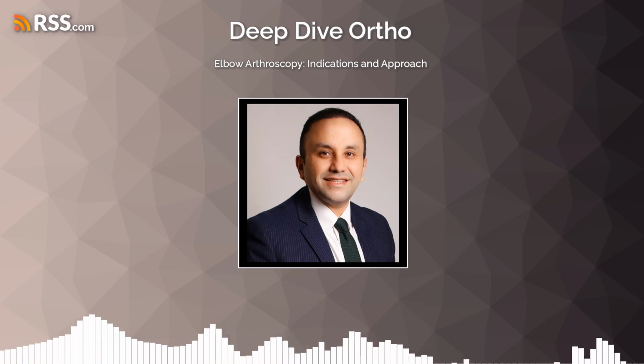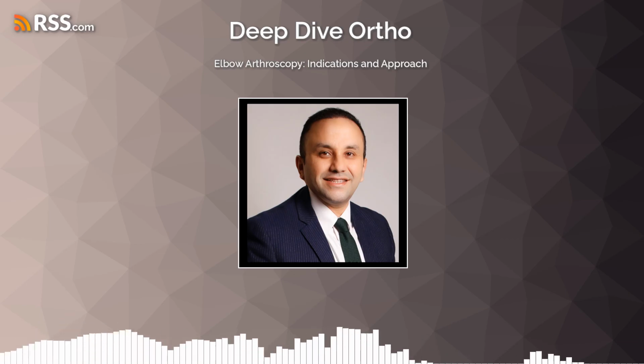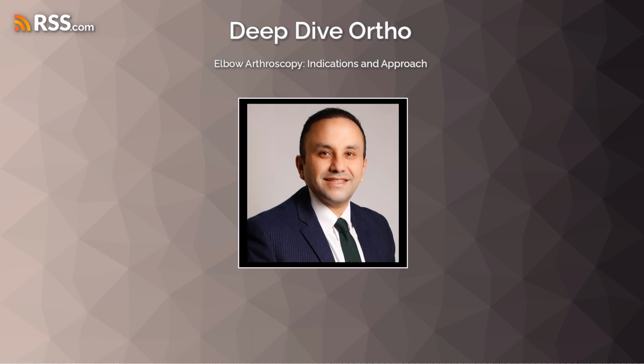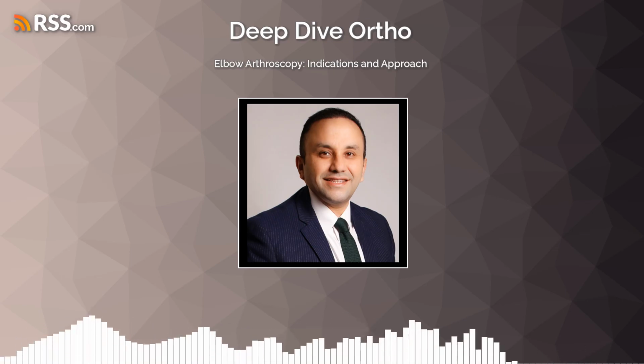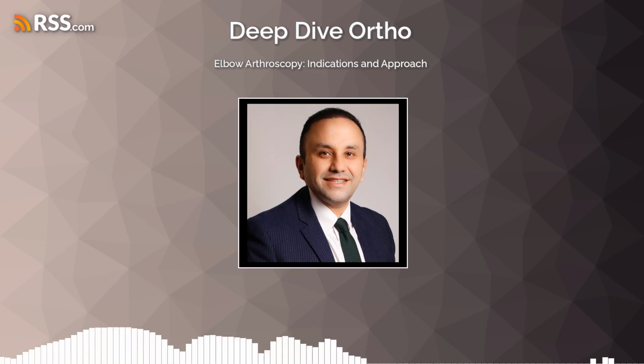This would involve using advanced cannula systems to precisely insert biologic grafts, perhaps cartilage from another area, into the elbow joint, which could then be secured with sutures or suture anchors. Similarly, we foresee arthroscopic assistance through small incisions, facilitating prosthetic replacement of the radial head or capitellum, further expanding the scope of minimally invasive elbow surgery and offering patients new options for complex conditions that traditionally required larger, more open approaches.